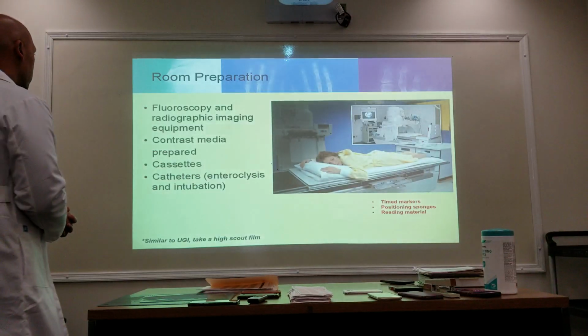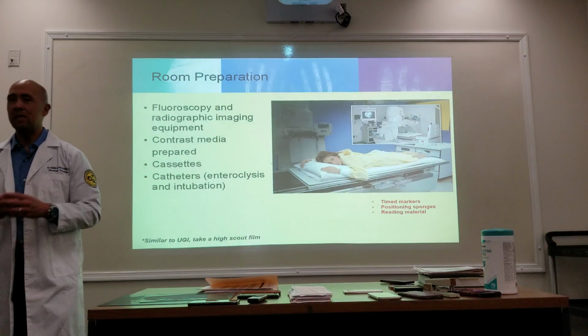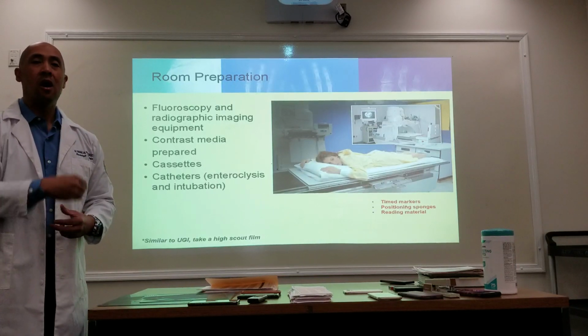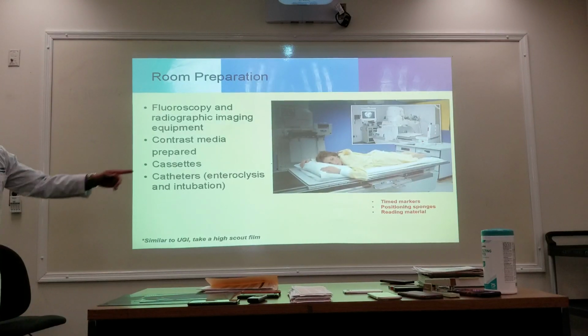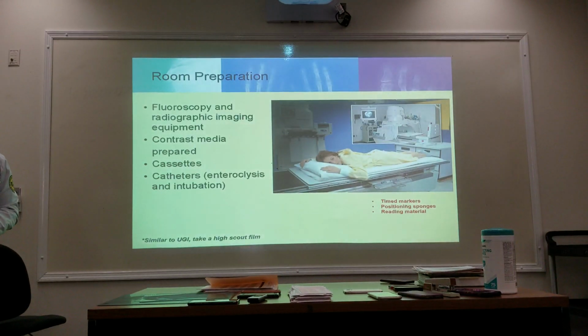All right, so before you make the image final, you want to make sure that you are annotating the times of the x-rays that you take. I'm going to explain this later on, okay? Also make reading material available. Again, this will make sense here in just a little bit.